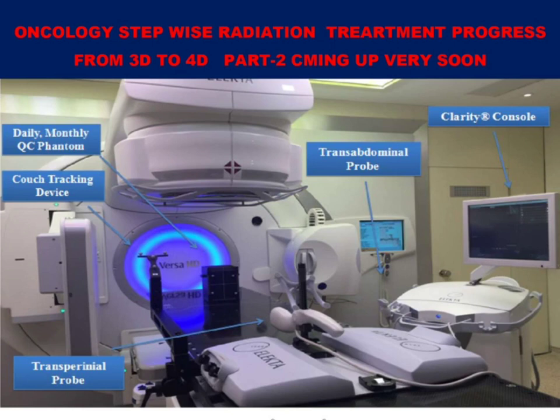Then you see here the linear accelerator with the EPID. Sometimes image verification just before the treatment is very much required. The same linear accelerator's low energy beams can be utilized for taking the images with the flat panel matrix, and then you can see the image, and recorrection can be performed. With electronic portal imaging devices you can not only verify the image, the dose given to the area of interest can also be calculated. It can store the dose.